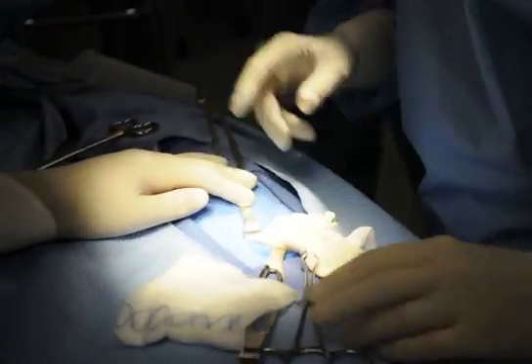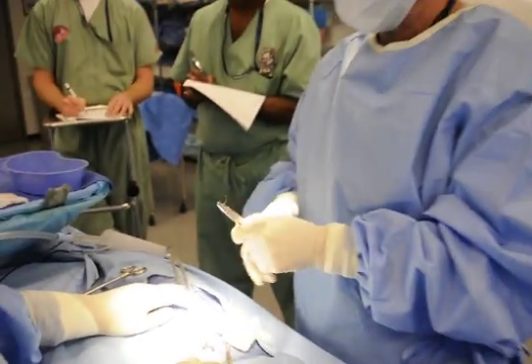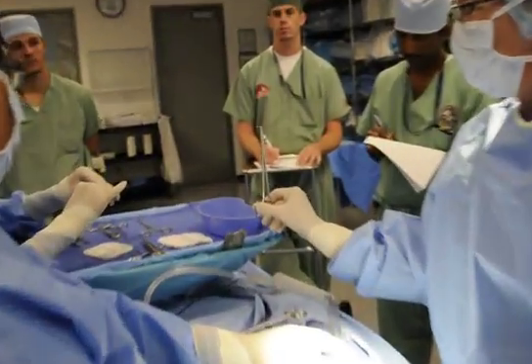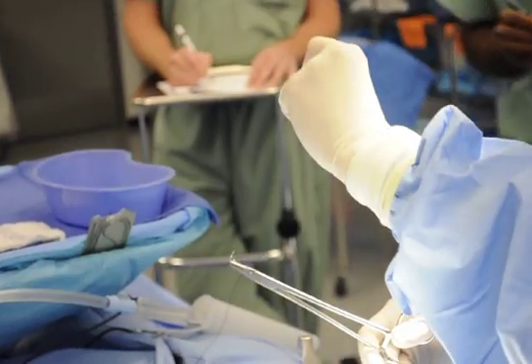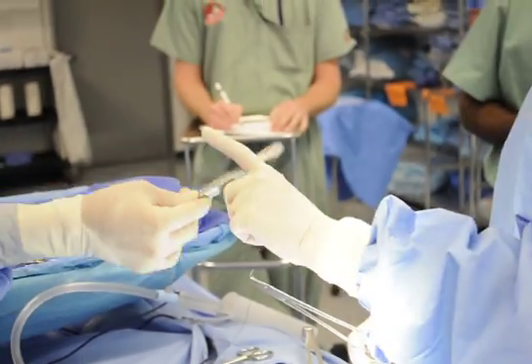Okay, so now we're ready for the purse string. Remember that the needle goes on 90 degrees, not angled — 90 degrees. And what am I going to want with this? Why would I use teeth on the bell?